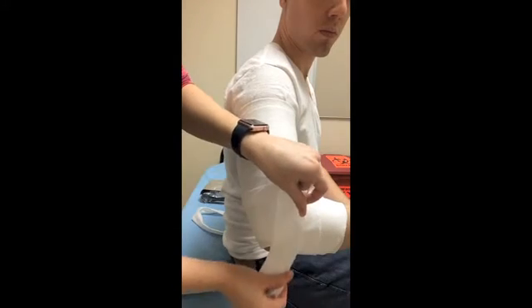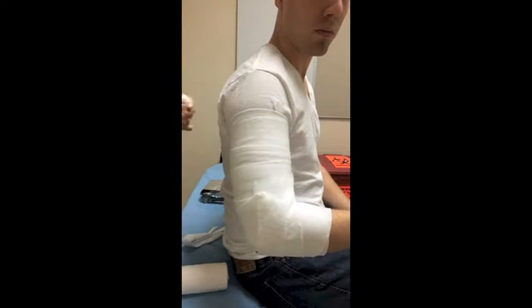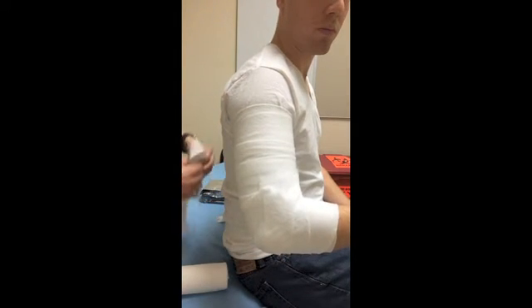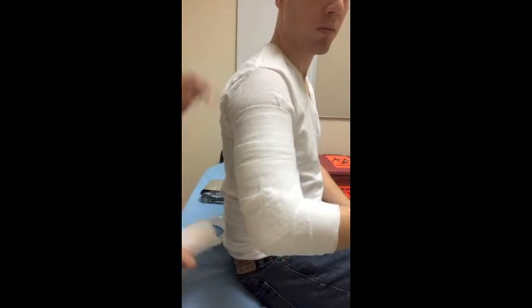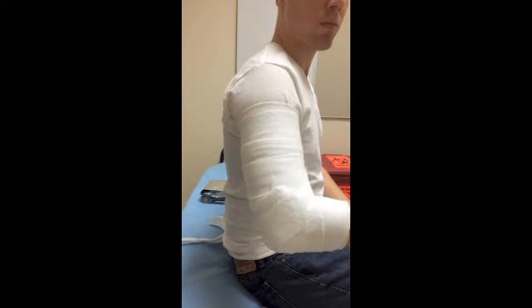So we're going to use nice small pieces to finish our padding around to the elbow, making sure to get those 3 layers in while keeping the elbow at that 90 degrees. Okay, so once you have 3 layers on the elbow, we will need to pad up and around the shoulder to where the splint ends.